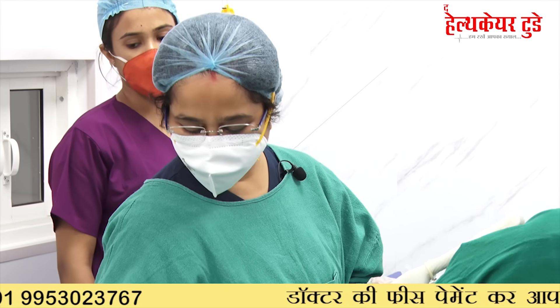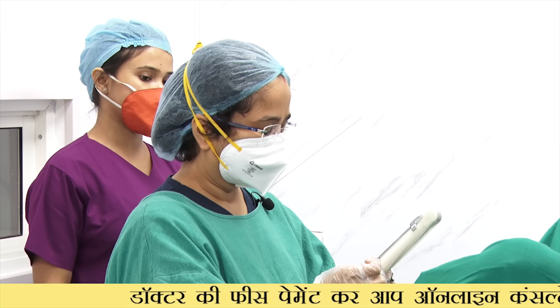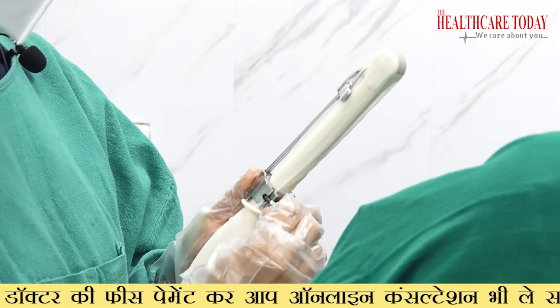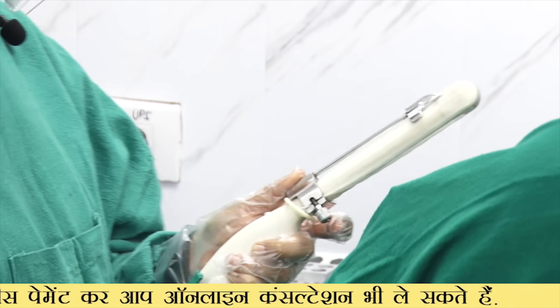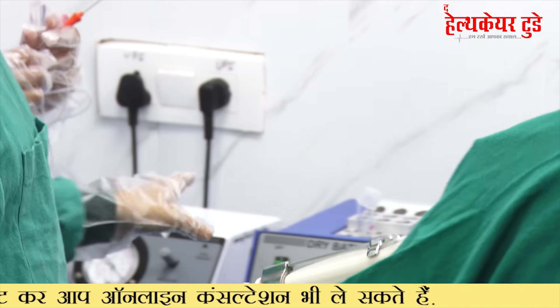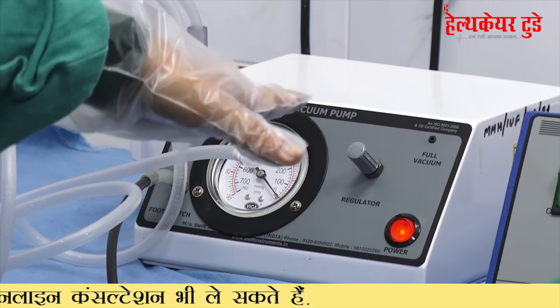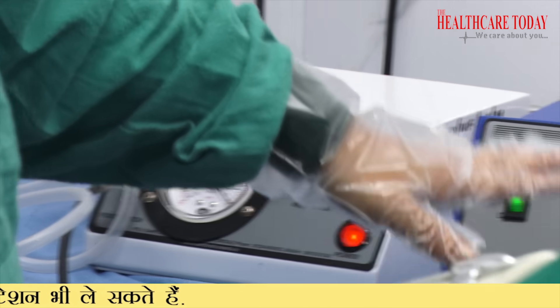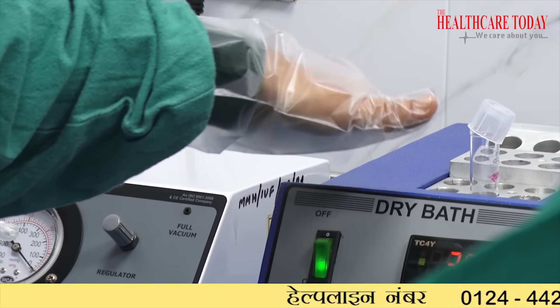After covering the probe, we have a guide. After checking our equipment, this is a suction pump which helps us to aspirate. When the follicle fluid comes out, it stays warm — it is necessary to maintain the temperature.